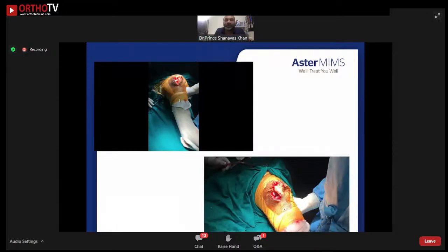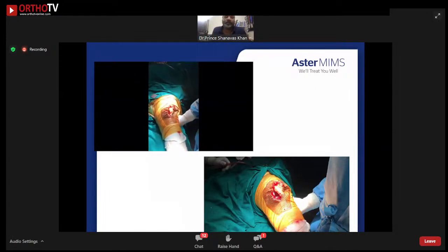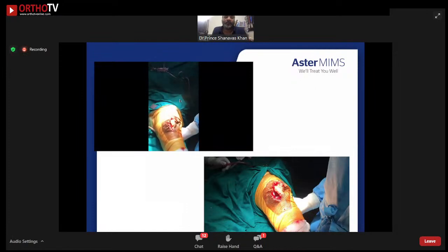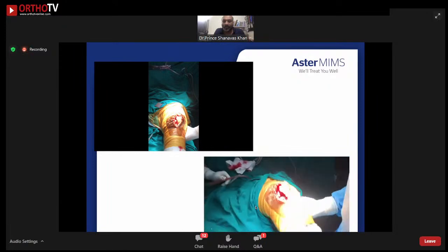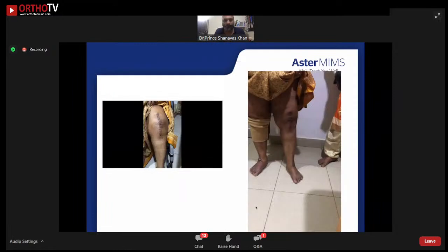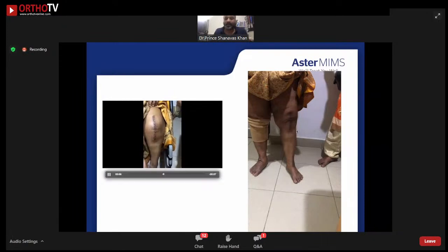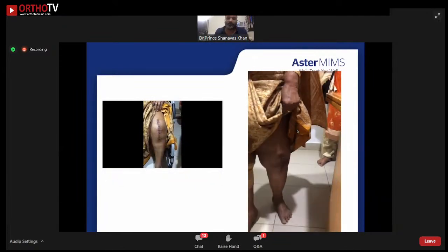These are pictures of the same patient which I showed earlier. This is after the medial parapatellar approach without any ligament balancing or bony cuts. You can see that the patella dislocates every time I flex it. Now see, after my releases, bony cuts, and implantation, the knee is absolutely stable. The patella is in the center. You can see the no-thumb technique. This is the same patient just postoperatively with the stitches in situ: the patella is stable, not dislocating, and the valgus is corrected.